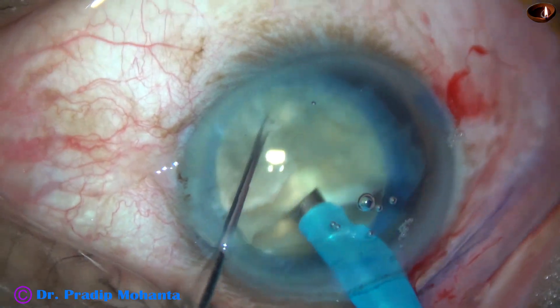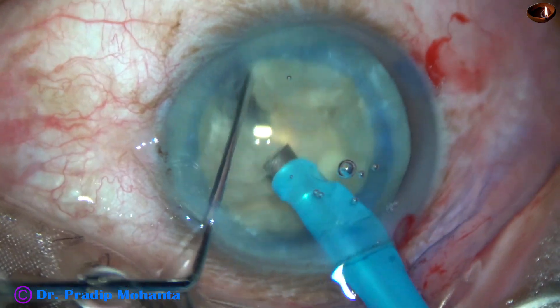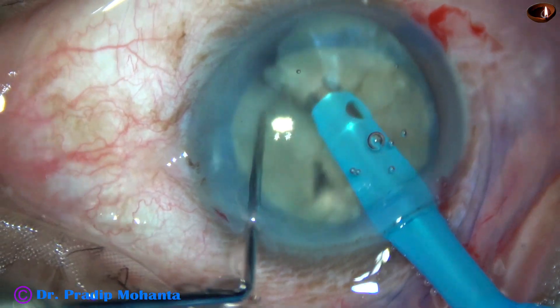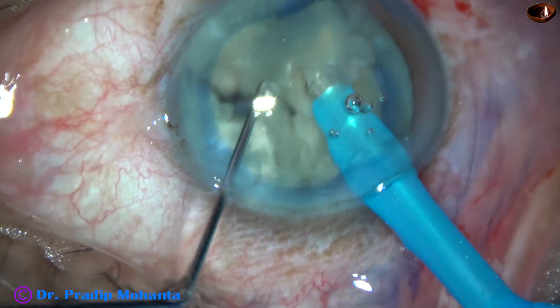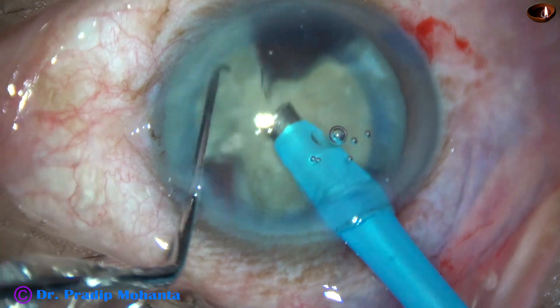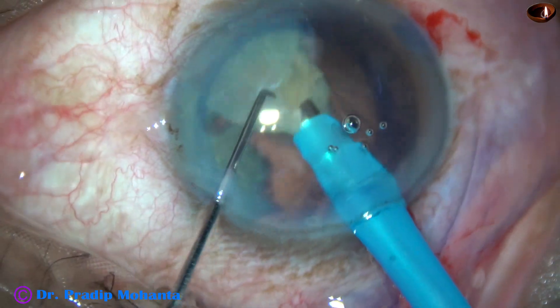Now, this hemi-nucleus has been divided into three fragments. I come to the other hemi-nucleus and divide it into two pieces. So the nucleus has been divided into five separate fragments. They are free. I start emulsifying each nuclear fragment one by one.